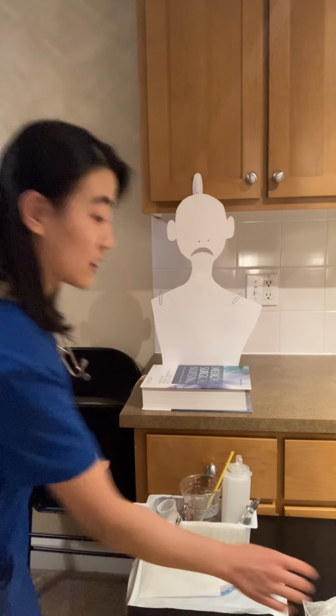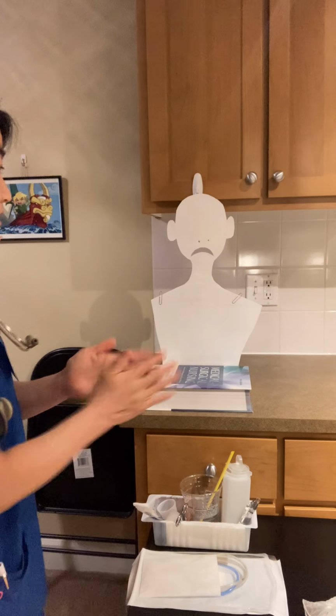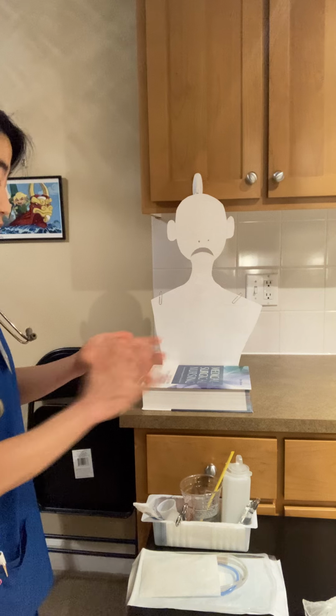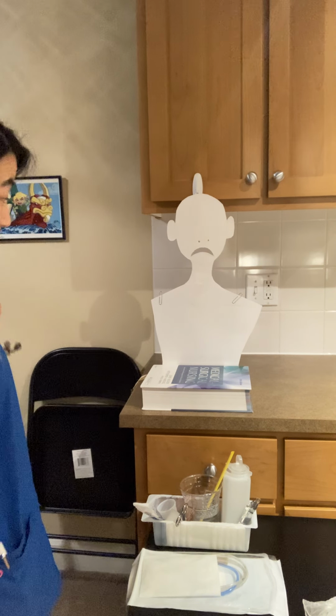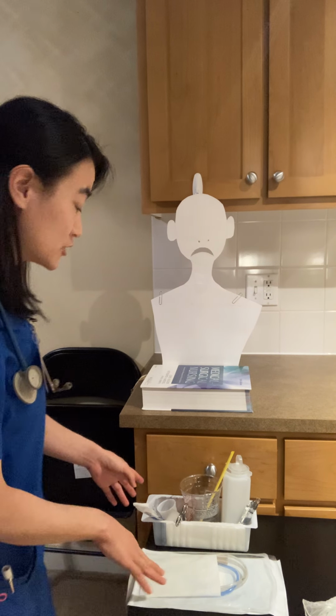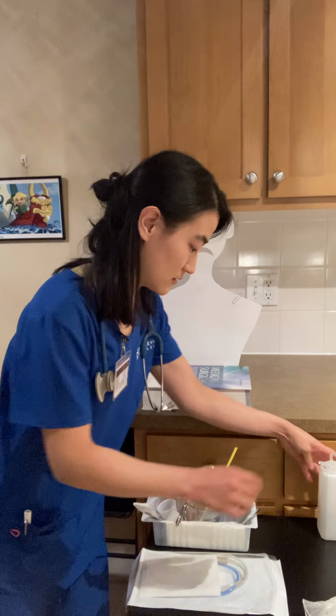Hi, my name is Yang Han. I'm going to be your nurse today. I'm here to insert a nasogastric tube in order to decompress your stomach, and that's going to just help you feel a bit of relief. Do you have any questions or concerns before we start? No? Okay, great.